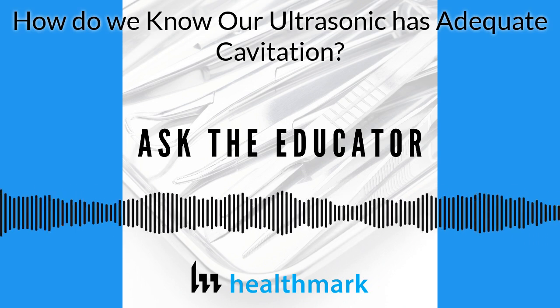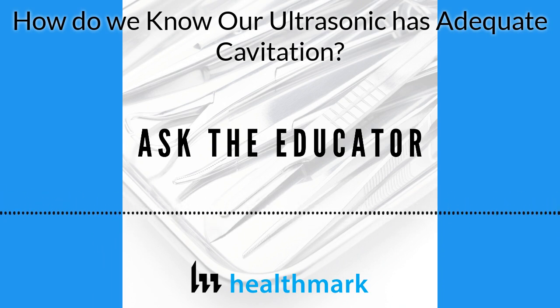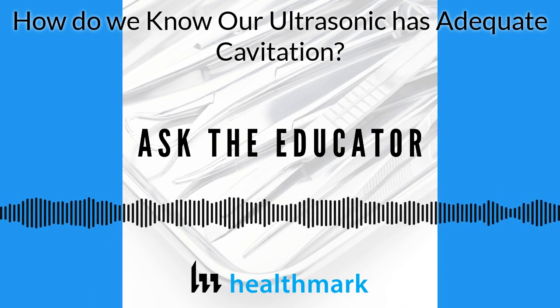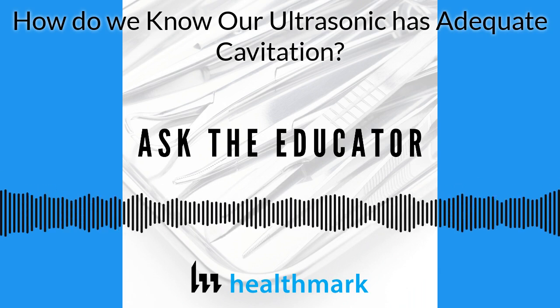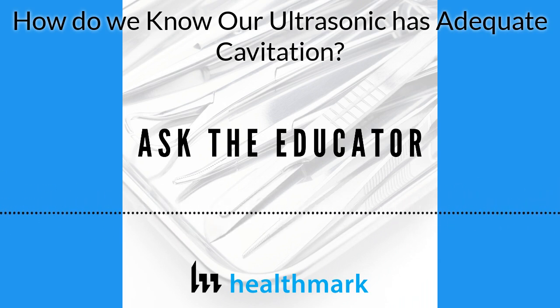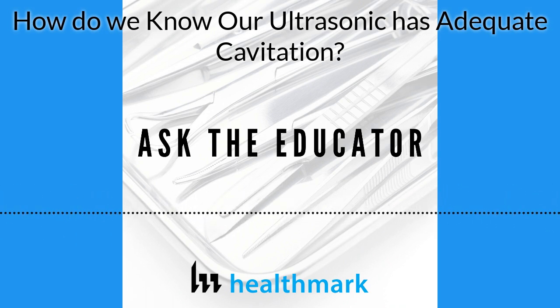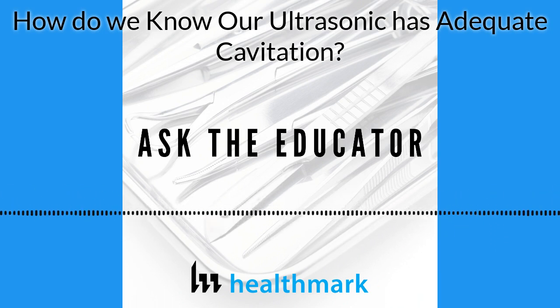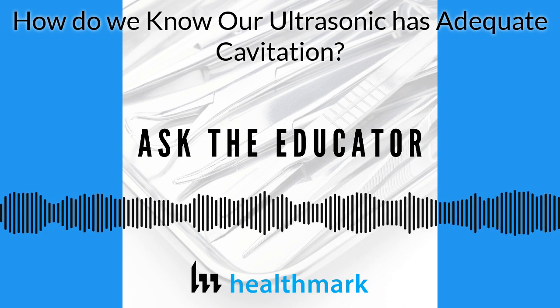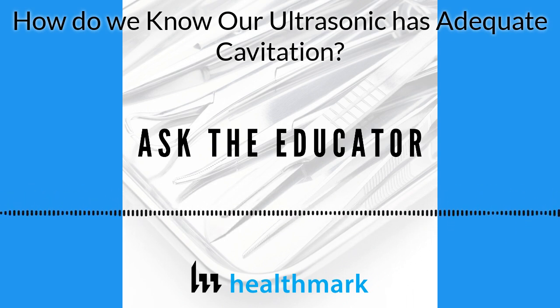So now basically I've got this really expensive machine and I'm only using maybe the bottom level that's actually closest to the transducer and passing, or maybe the first and second level if the second level is passing. But that is a huge deal to me. And I feel like, yeah, you explained it real well. I hope this makes sense to the listeners, because it was a huge deal to me when I first learned about it, because I didn't have a multi-level ultrasonic in my department.